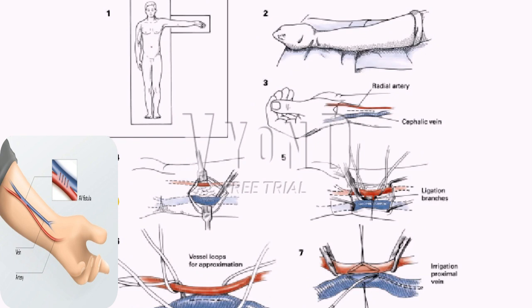The radial artery is then dissected for a distance of 2 to 3 cm. There is a vein on either side of the radial artery that may be ligated or freed from the artery. The artery is encircled with vessel loops proximally and distally, and side branches are ligated as necessary with 4-0 silk. Both vessels must be freely mobilized to enable a tension-free anastomosis. The artery and vein are then encircled with a single vessel loop both proximally and distally to allow alignment of the structures.